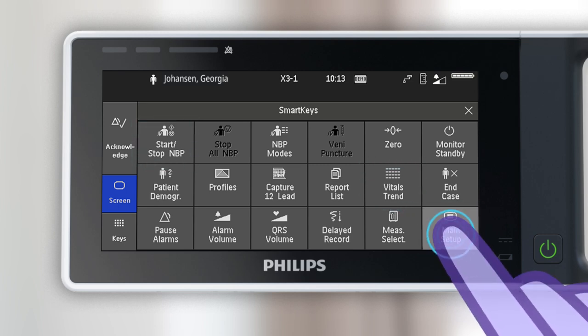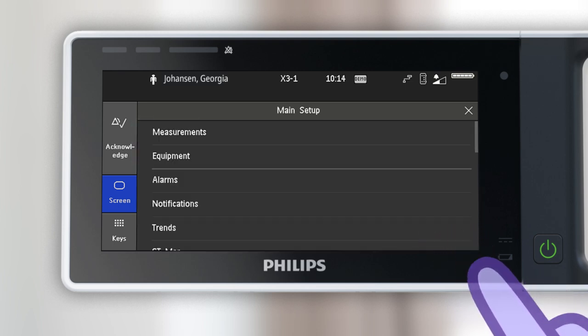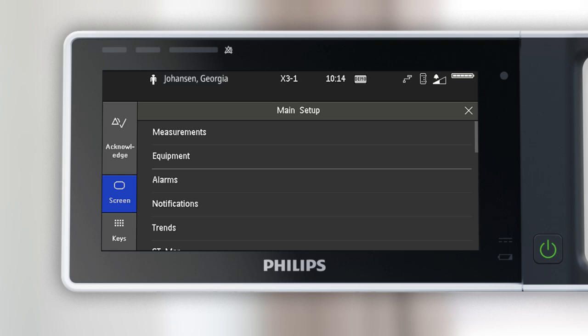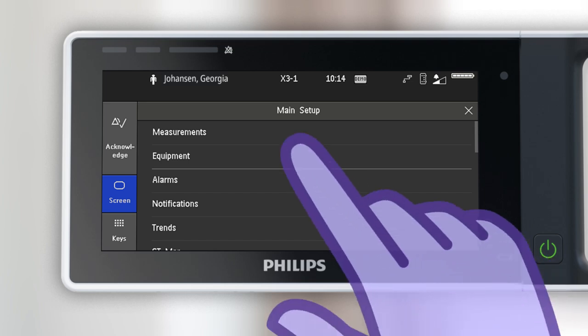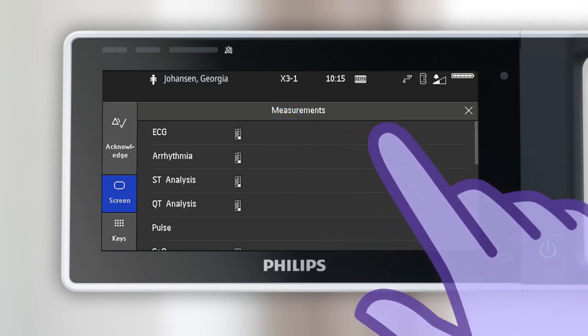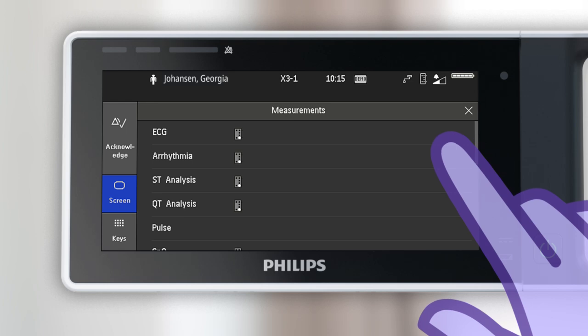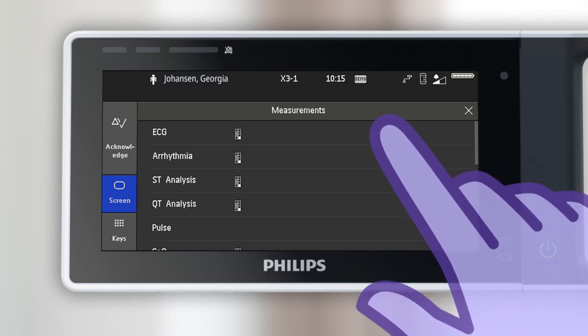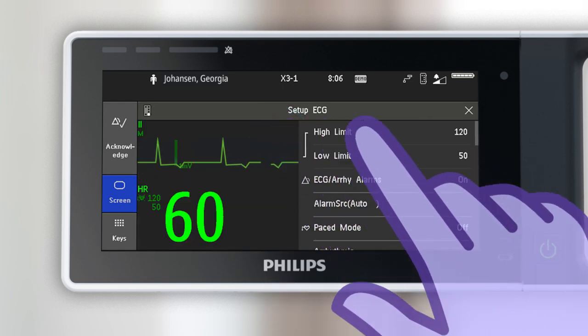Touch main setup to view all setup windows in the monitor. From the main setup menu, touch a menu option to view additional settings and features. For example, touch measurements to view all available clinical measurements, then touch a measurement to adjust its settings.